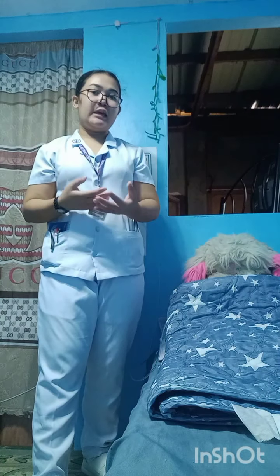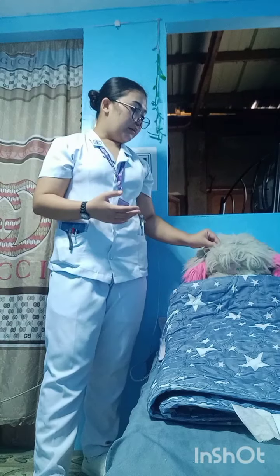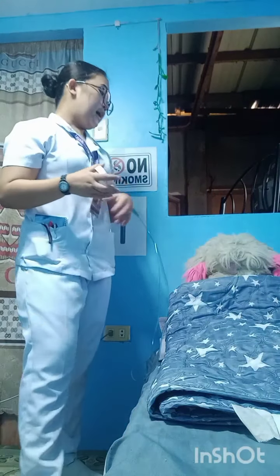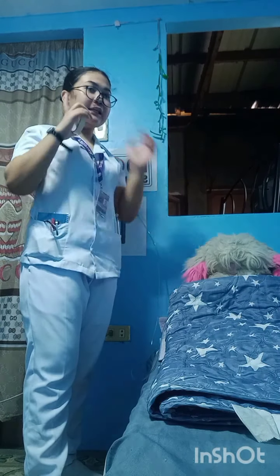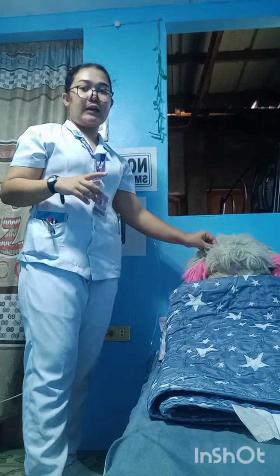And after that, if the cannula will not stay in place, we're going to tape the side of the face of our patient so that it will not move. But sa mga patient naman, mostly kapag totoong patient natin, hindi talaga mag-move yung cannula sa cheek ng ating patient.